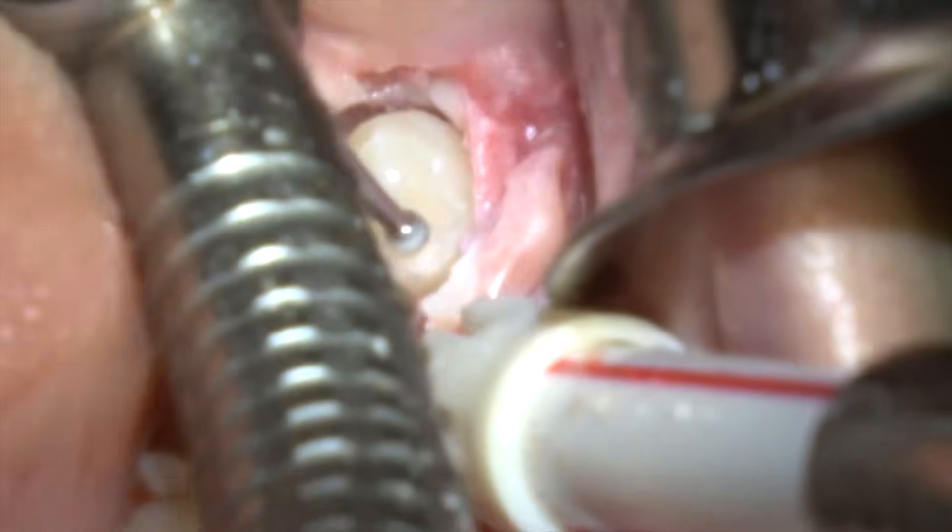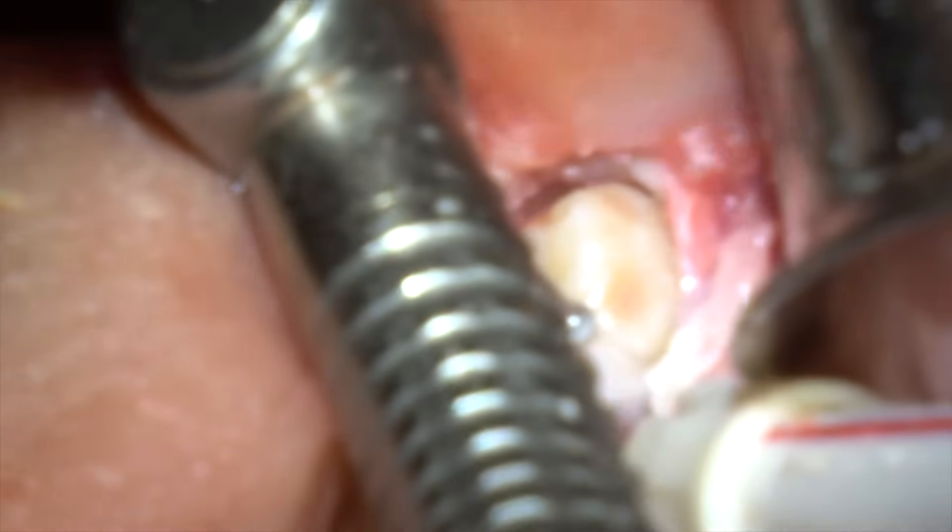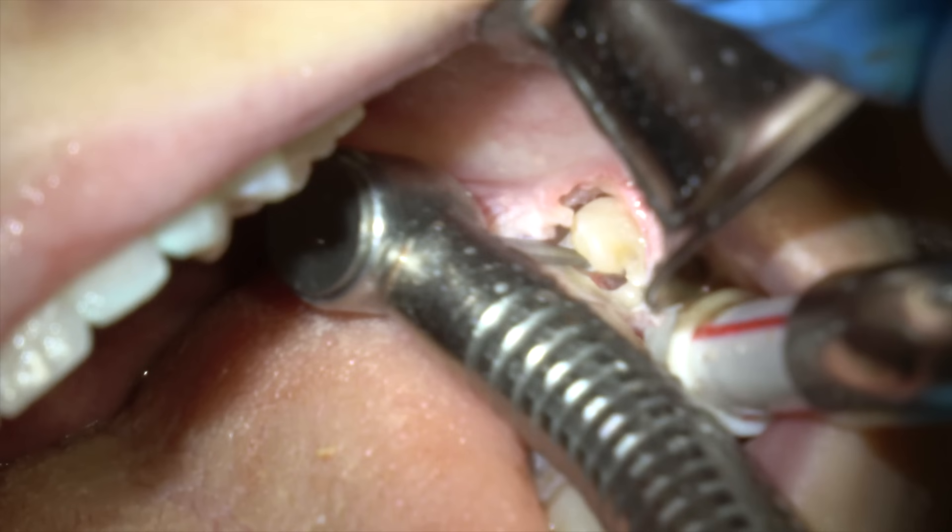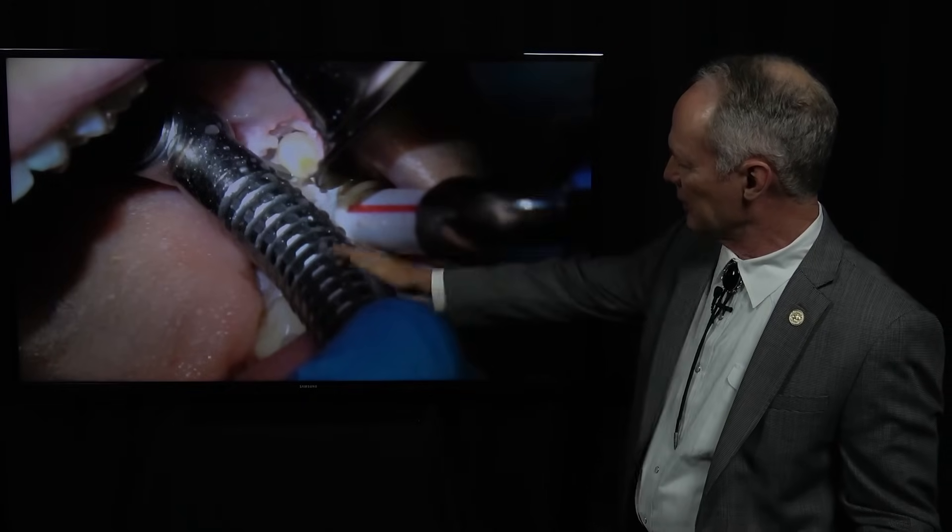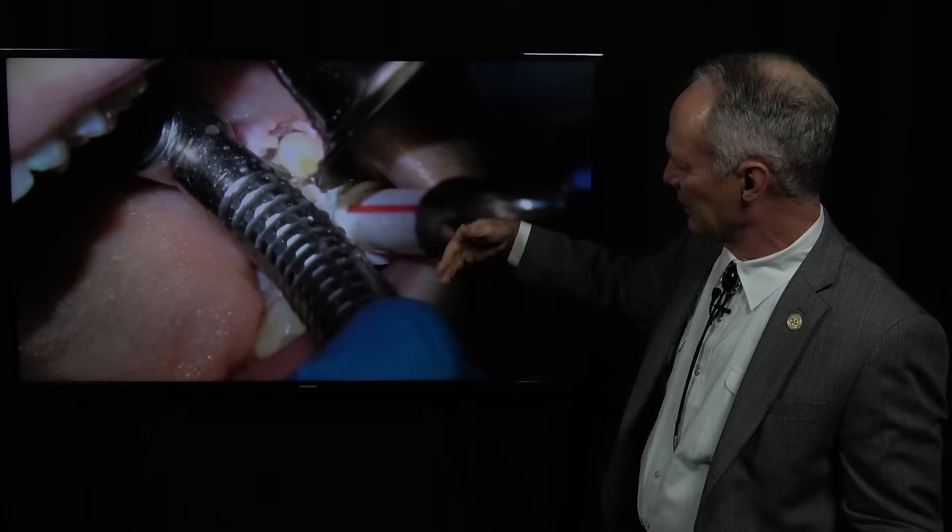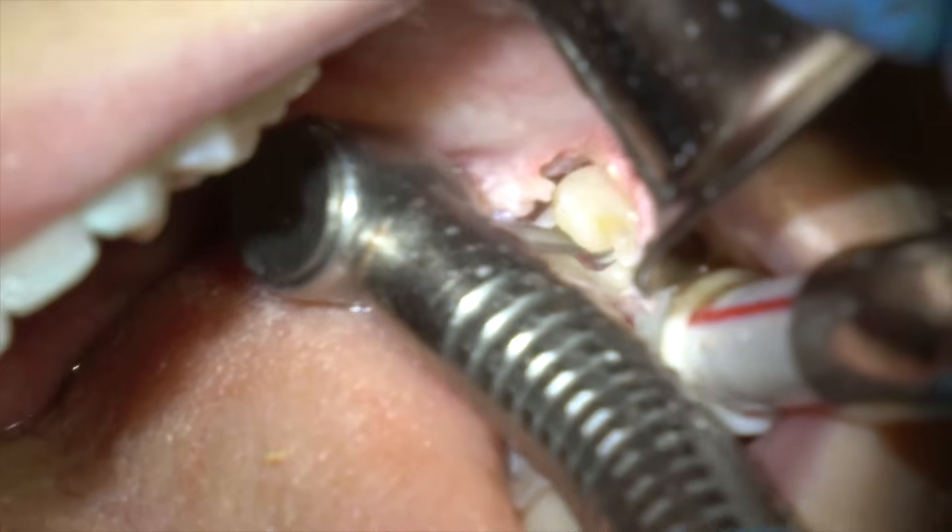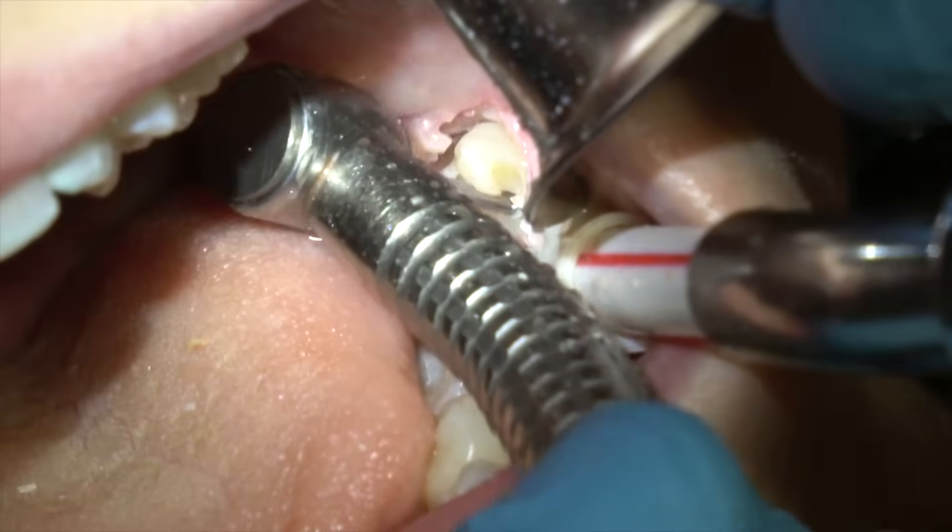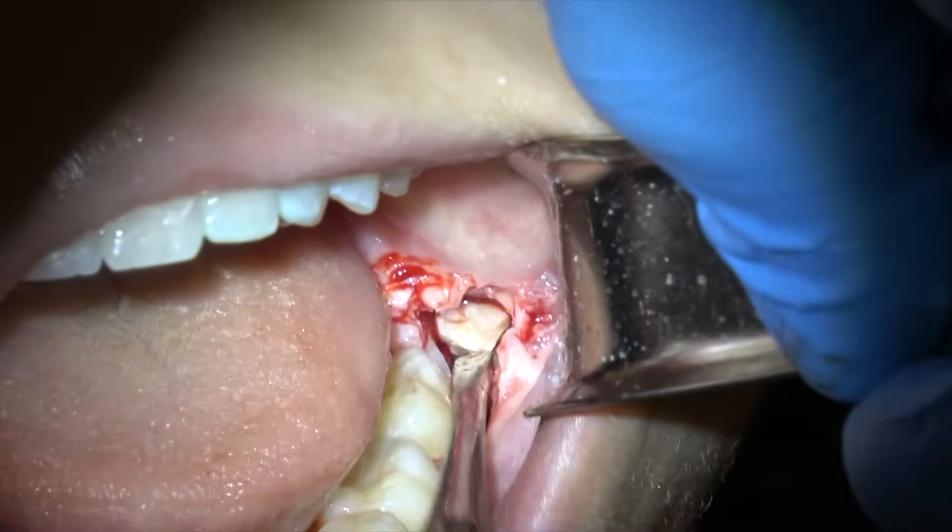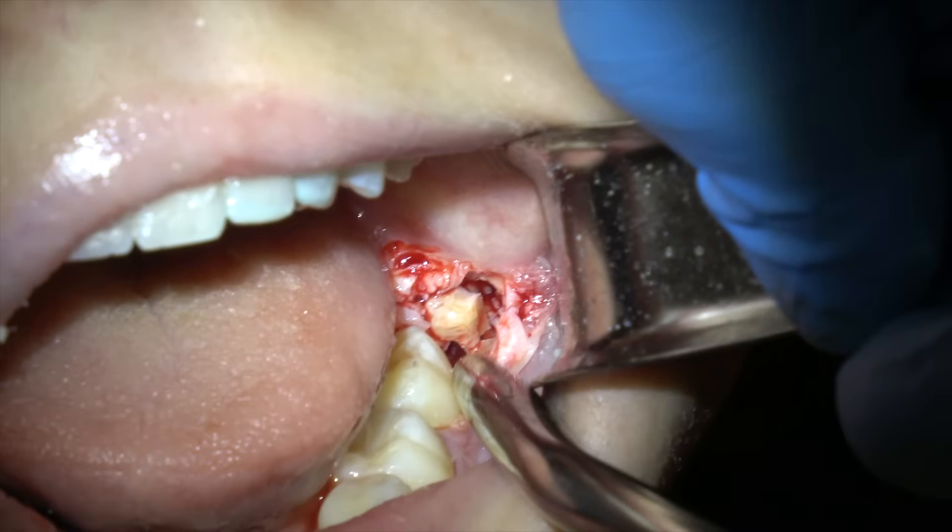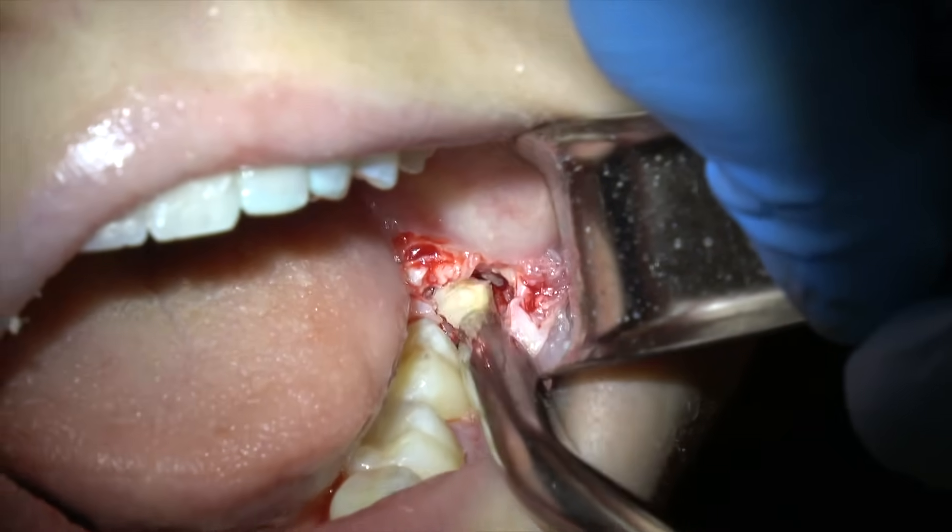So I'm just cutting through the mesial part of the tooth. Now I'm separating the buccal root from the lingual root—the mesial buccal root from the mesial lingual root. I'm going to take them out in two parts. And this is just an elevator. I'm just separating the parts.